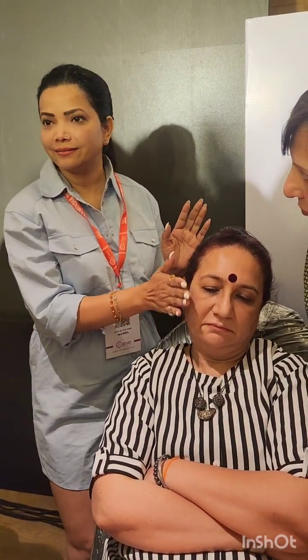I have covered everything: vectors, zone of action, what thread we are going to use, and why dermal threads are called floating, because there is no anchor point for them. It is floating in the dermis and it is injected superficially. It is placed superficial in the dermis. You cannot place it subcutaneous because the main idea is to regenerate the collagen. So it will give you only textural improvement.